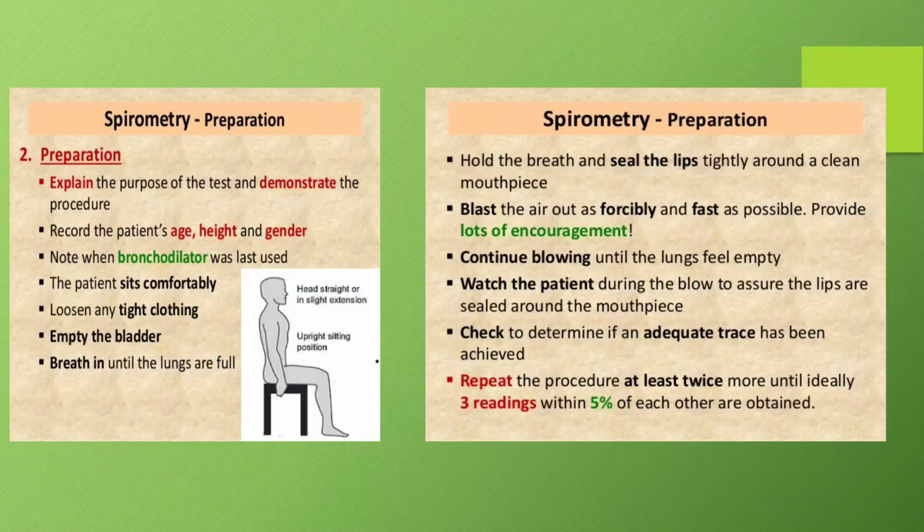Now we will ask the subject to hold the breath and seal the lips tightly around a clean mouthpiece. Then blast the air out as forcefully and as fast as possible, and continue blowing until the lungs feel empty. Usually the air should be blown out for 6 seconds.